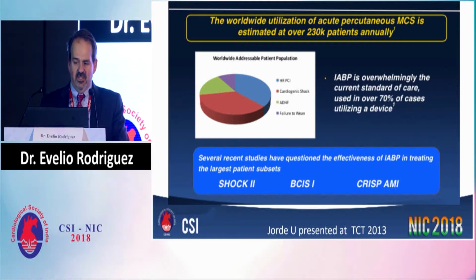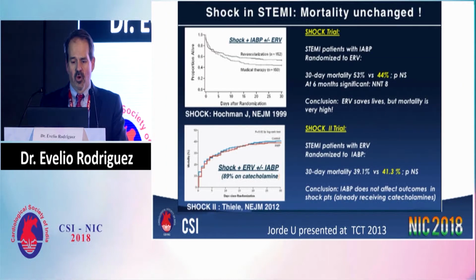The reality is that there's no data showing significant improvement in survival using the balloon pump, whether in the SHOCK trial or the SHOCK 2 trial. None of them have shown any significant benefit in emergency revascularization.